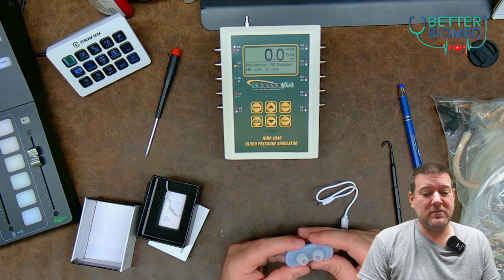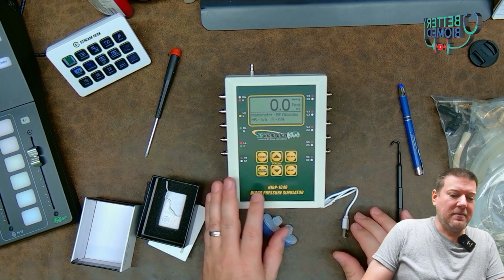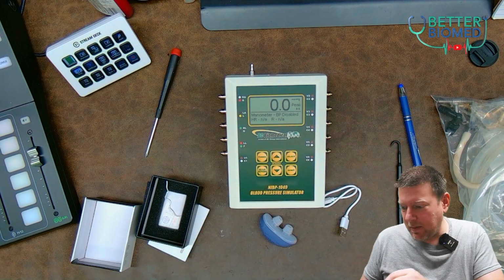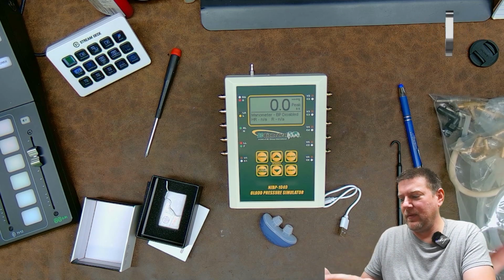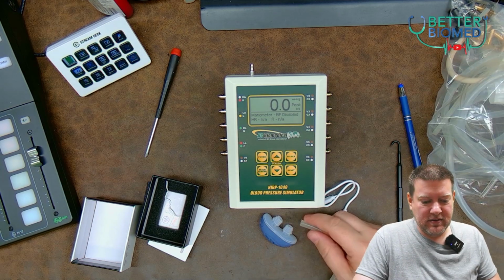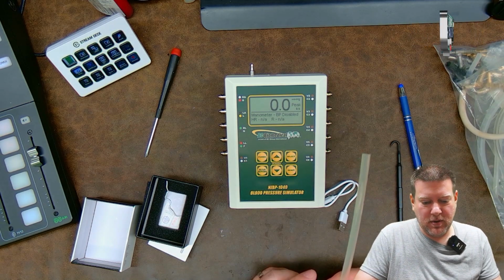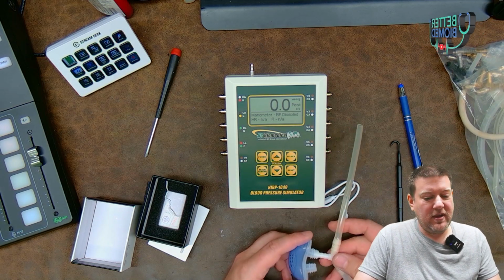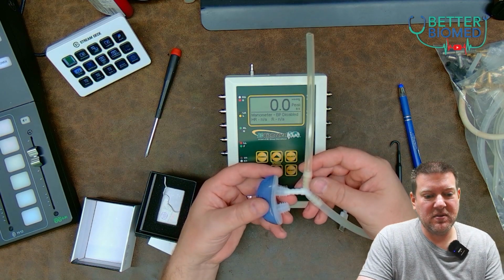millimeters of mercury. So what I have here is a manometer. I've got my NIBP-1040. It does have a manometer function. And I think we might be able to do this accurately. How are we going to do this? Plug this guy in. It has a silicone seal, it does seal.